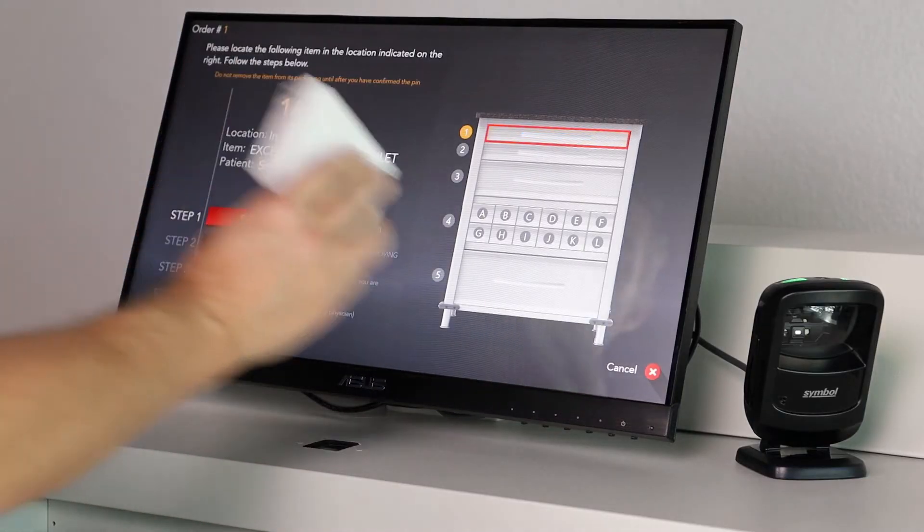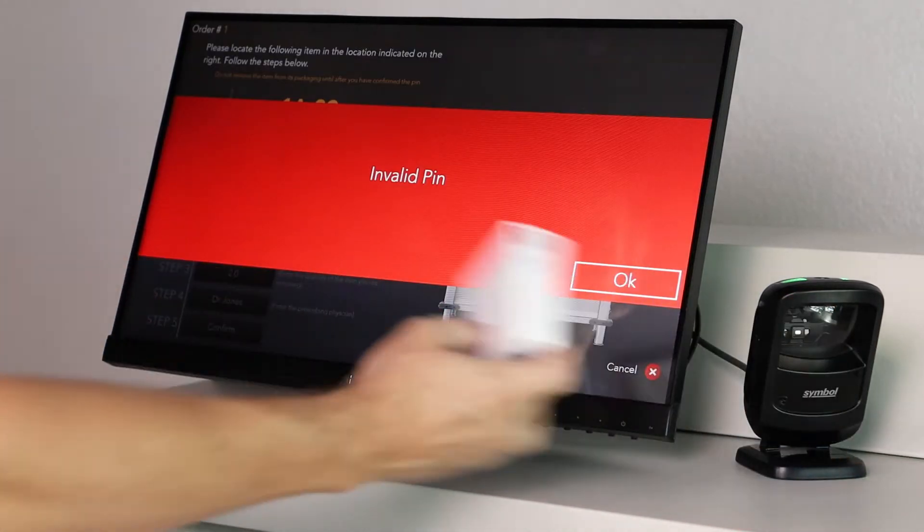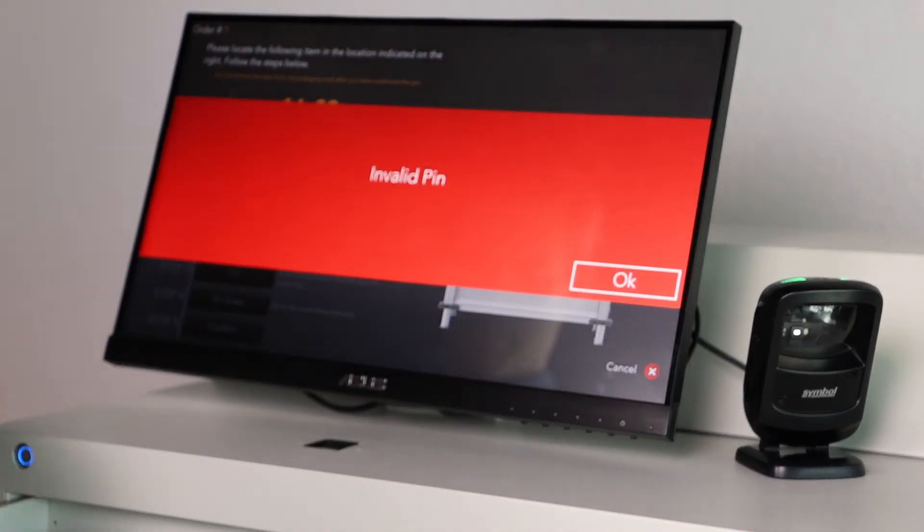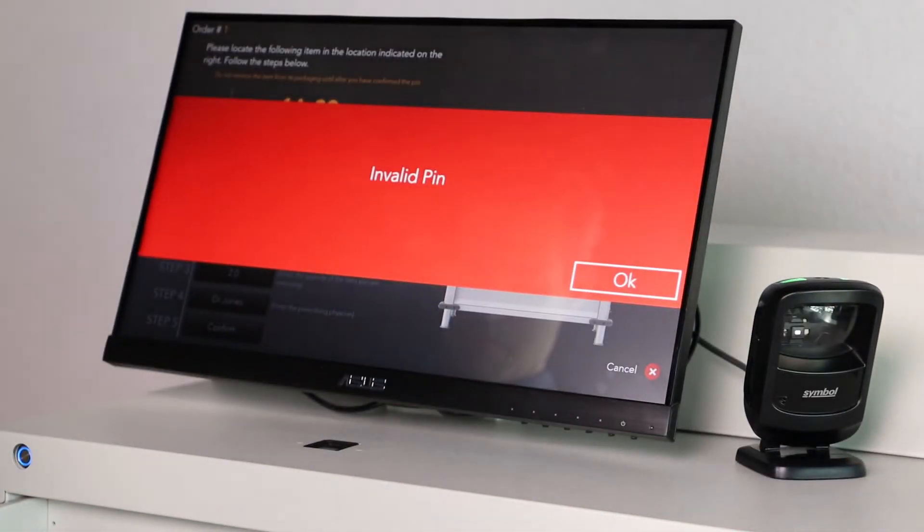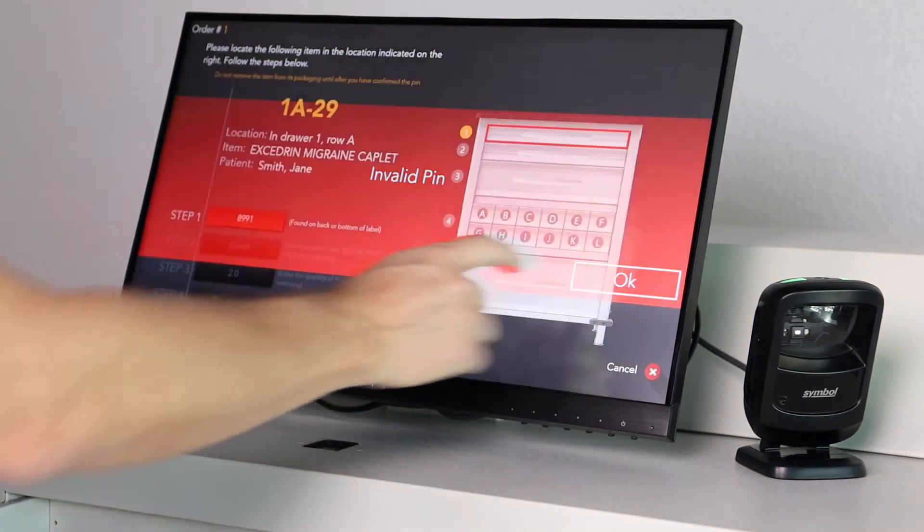Scan the barcode to verify you have the correct package. Statsafe will not allow the process to proceed with an incorrect package.